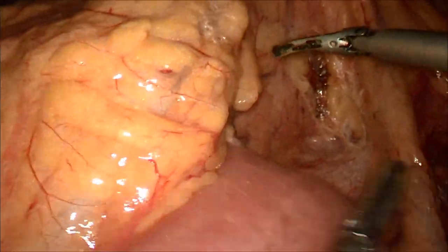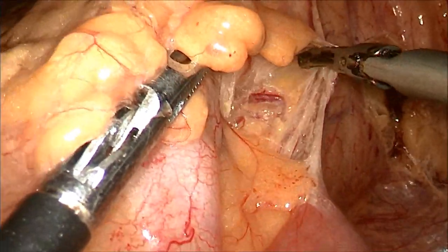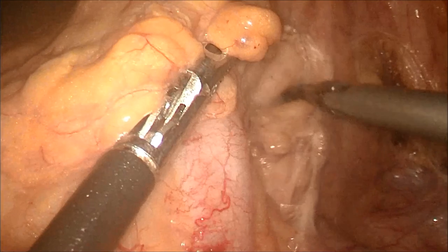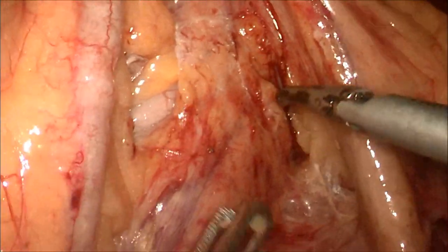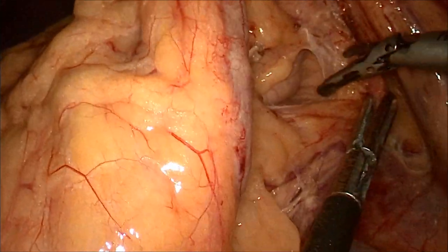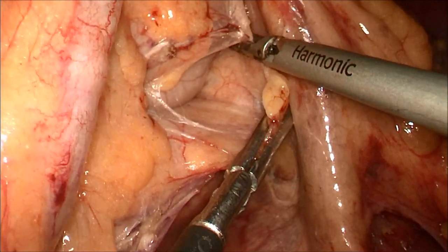At this point in the superior dissection, a mistake which we can easily make is getting into the retropancreatic plane. As we do in the right colon mobilization, where we stay anterior to the duodenum and avoid going retroduodenally, likewise in this part of the dissection, we avoid going into the retropancreatic plane and stay anterior to the pancreas.